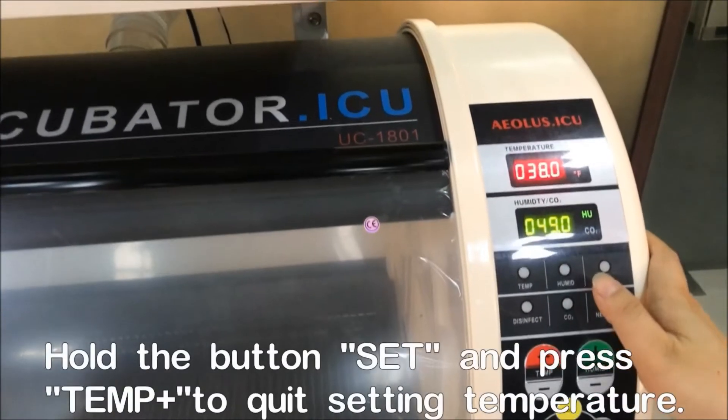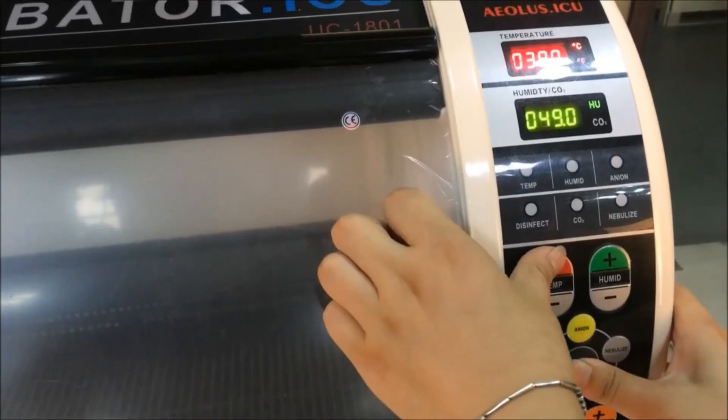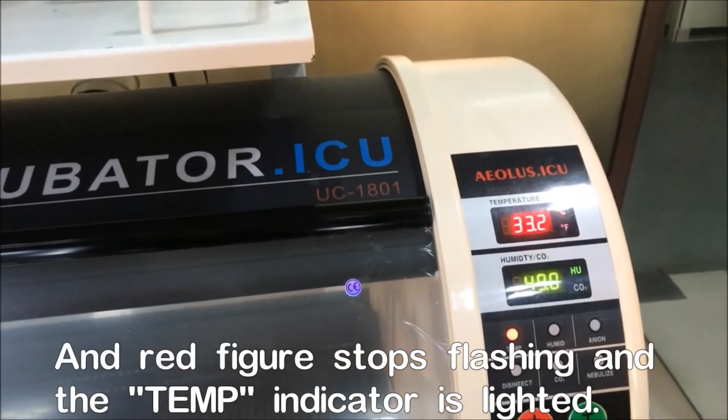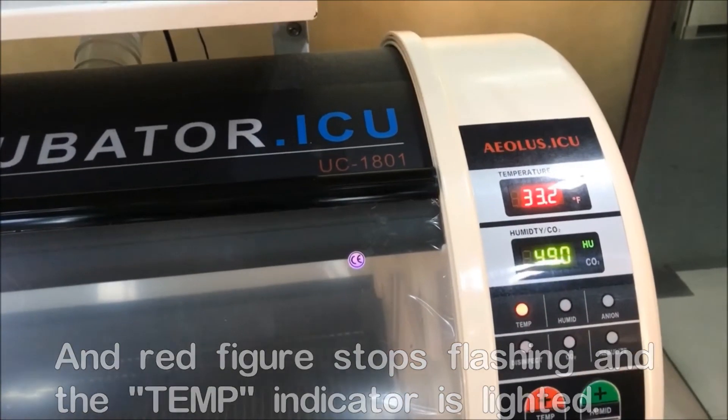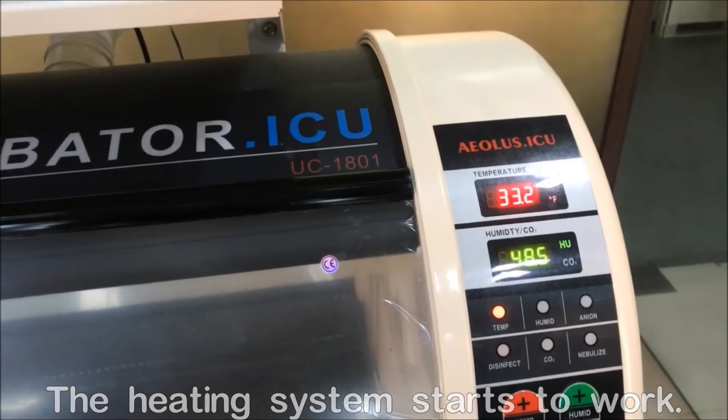When you finish setting, you need to hold the Set button and the temperature plus button to confirm and exit the setting mode. The setting is now triggered and you can see the temperature light blinking, showing that it is heating up.